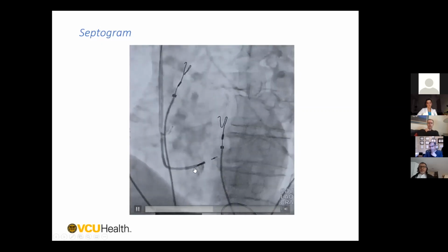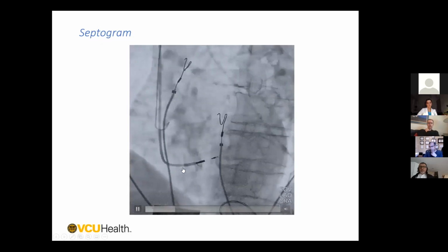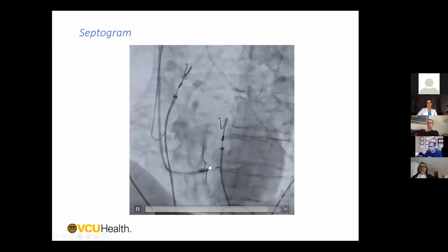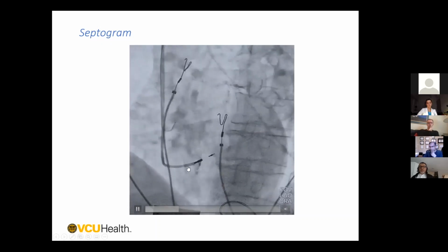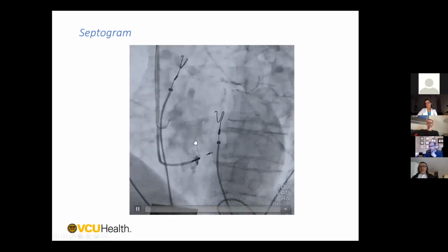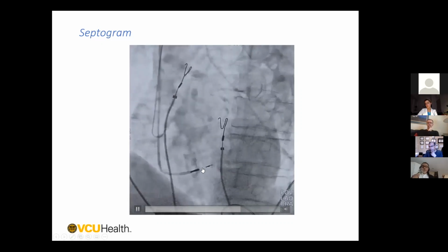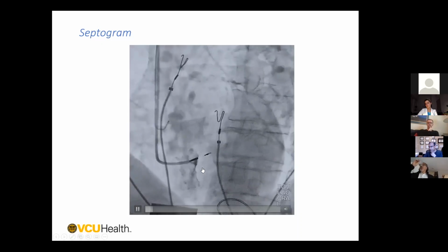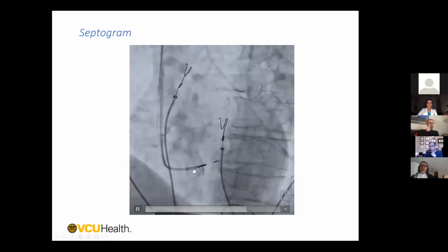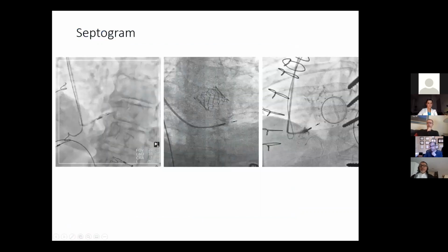You just bring back your sheath to make sure the sheath is not in the septum, because sometimes as you're screwing, the sheath can go in the septum and you don't want to inject dye into the septum. So pull your sheath back a little bit, inject your little bit of dye, and you can clearly see here that this is probably about 1.2 centimeters buried in the septum. If the proximal ring was also in there, then it would have been 1.8. So again, very nice way to demonstrate how deep you are into the lead.